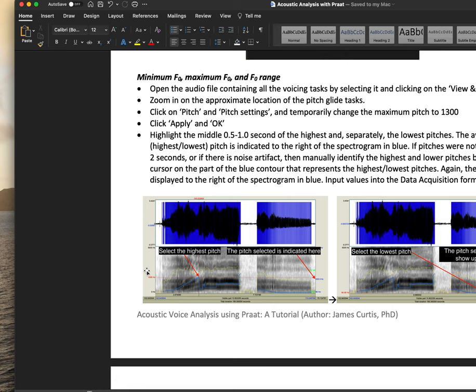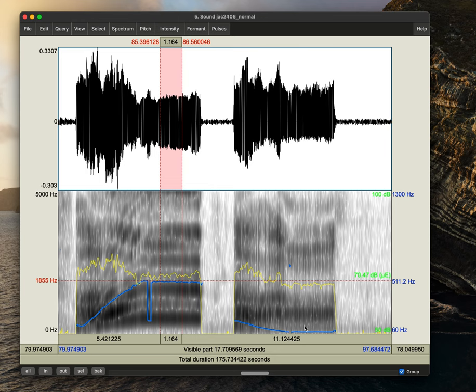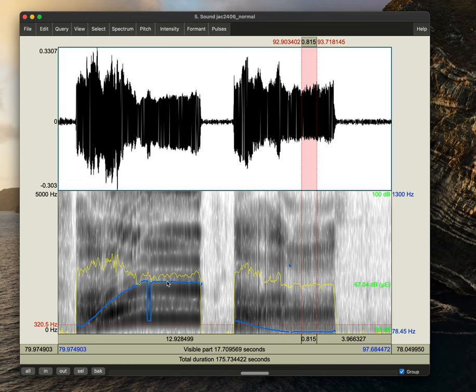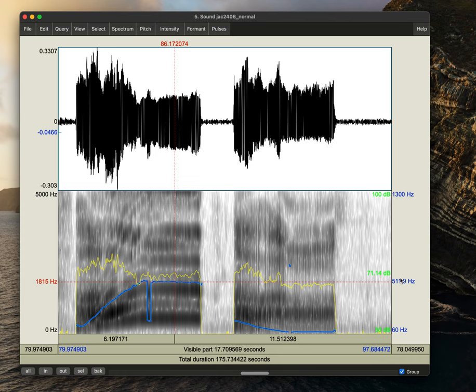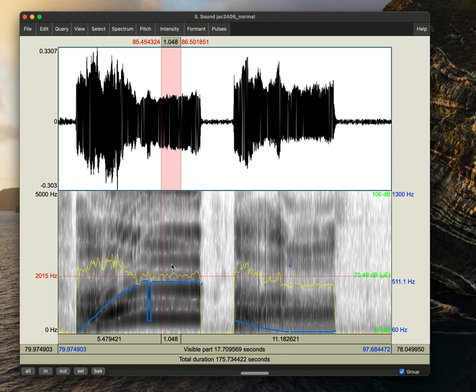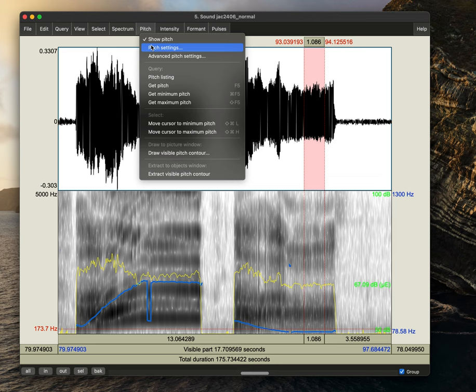So to look at our maximum pitch, we want to highlight the middle half or one second of the maximum and minimum pitches. We can see that the maximum pitch was around 511 Hertz. And we can see that the minimum pitch is around 78 Hertz. If we didn't have sustained phonation or if there was lots of noise artifacts, we might just click on a single point that looks representative and just use those single measures as well. But here we have very little noise artifact and it was relatively well sustained. So we'll just take the average here, 511 and the average here for minimum and that's 78.